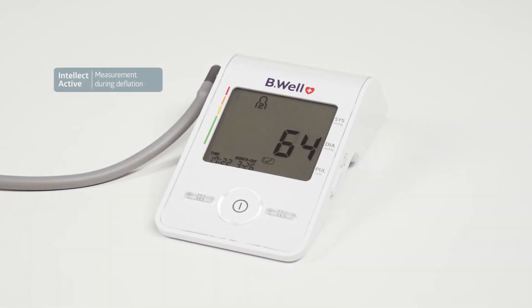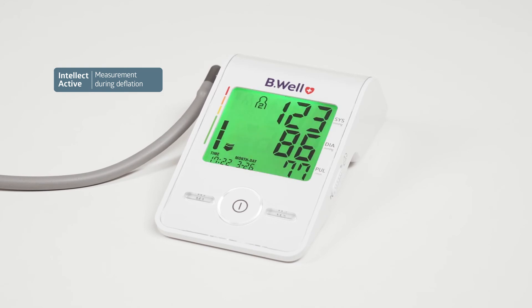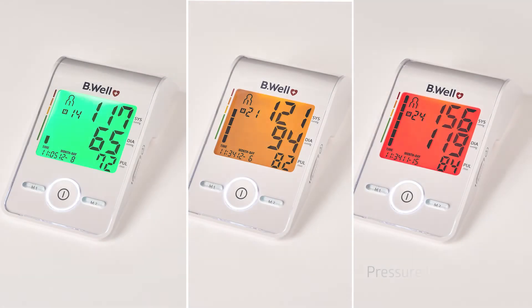Med55 measures with maximum care. It gently pumps air, adjusts to each user by determining the individual discharge level, and quickly releases air at the end of the measurement. Blood pressure and heart rate readings are displayed on the screen. The color backlight on the display indicates the blood pressure level.